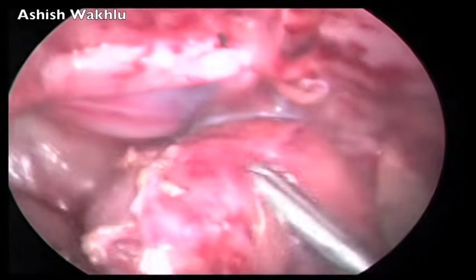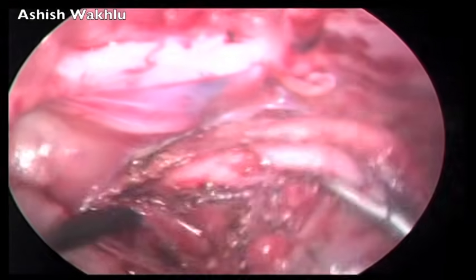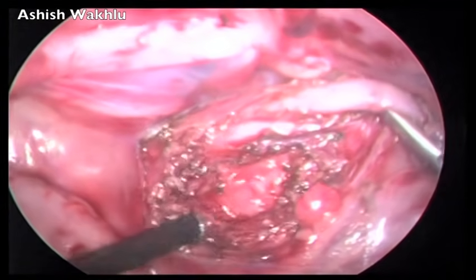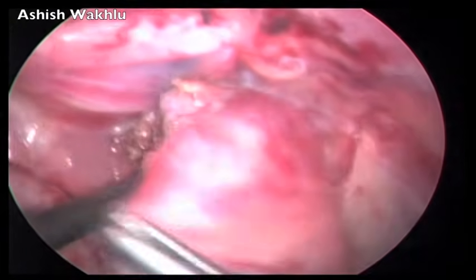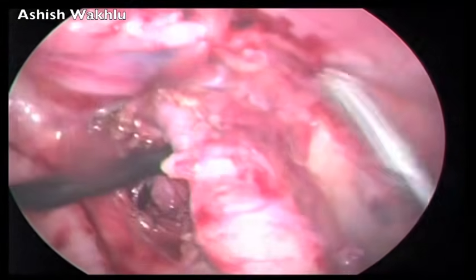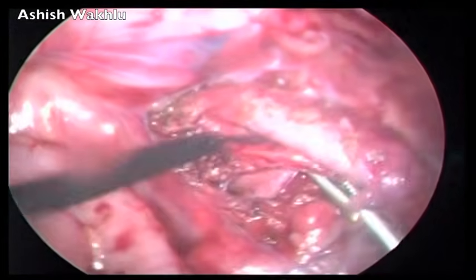So we are through the mesentery at one point, and this is a great advantage because you can now build up on this gap to safely mobilize an increasing length of the rectum and use this as a guide to dissect around the fistula into the pelvis.